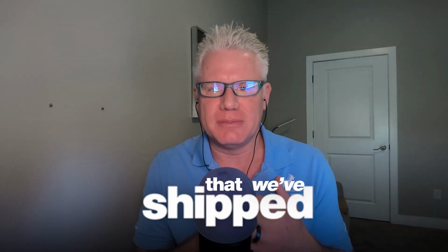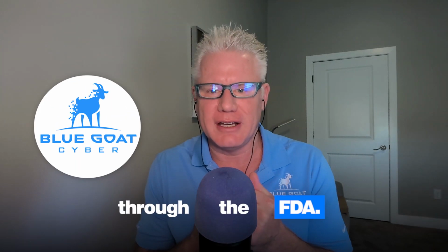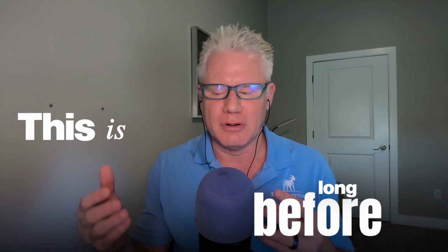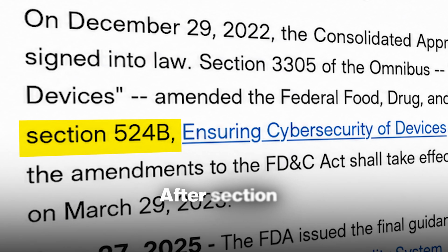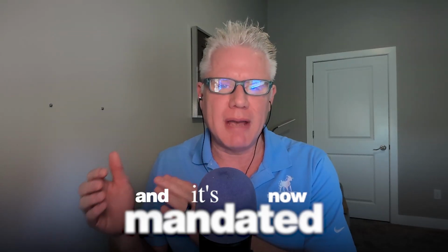250, that's the number of medical device submissions that we've shipped at Blue Goat Cyber through the FDA. I've been building SBOMs, or software bill of materials, since 2014. This was long before they were mandated. They were recommended best practices. After Section 524B came out, it is now the law, and it's now mandated that you have an SBOM and the associated vulnerabilities with your SBOM for a submission.